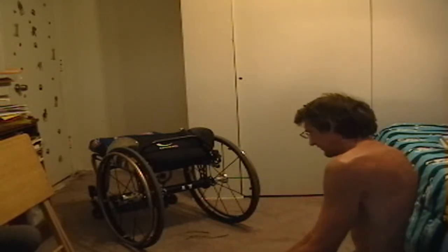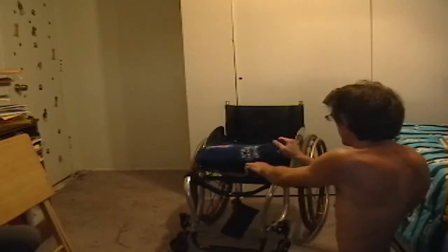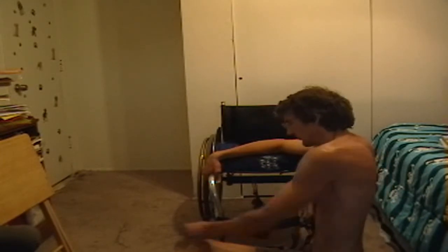Then I get my wheelchair and get it all ready for me to transfer into it. I put my legs, and if you have brakes on your wheelchair that's great because it stops the wheelchair from rolling back — or if you don't, it's nice to use a wall to help you.